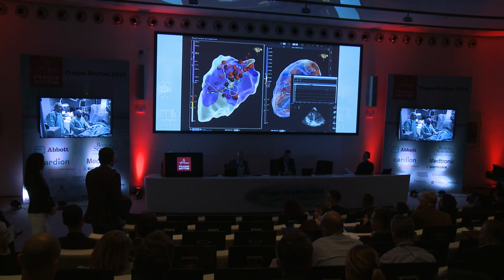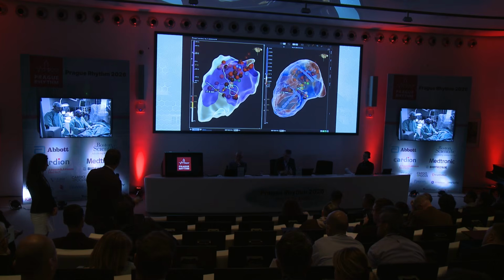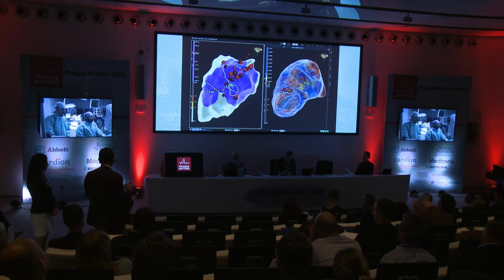Can I just comment on the appearance of this map, this propagation? It is because the electrogram is arriving on this side and that side of where you ablated at the same time. So it's not faster, it's equally slow. You've created block, therefore it's arriving on both sides at the same time, whereas before you had slowing on one side and then it comes around the other way. So I just want to make sure it's clear that you've created almost a line of block, and now the electrogram is just hitting both sides equally. It's almost like a CTI.